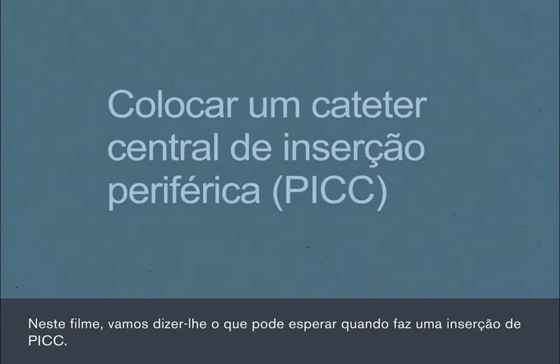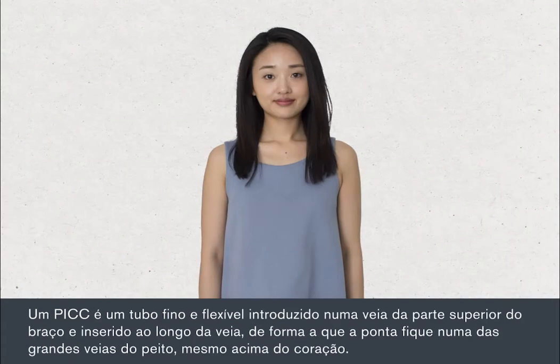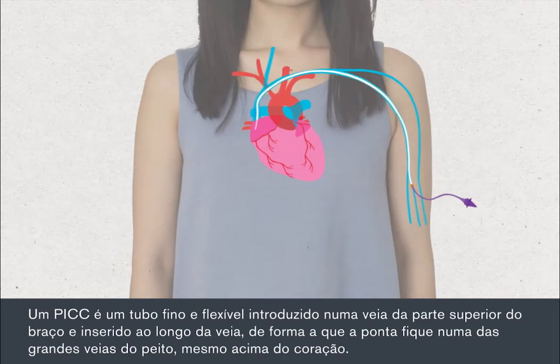In this film, we're going to tell you what to expect when you have a PIC insertion. A PIC is a thin, flexible tube that is inserted into a vein in your upper arm, threaded along the vein so that the tip lies in one of the large veins in your chest, just above your heart.